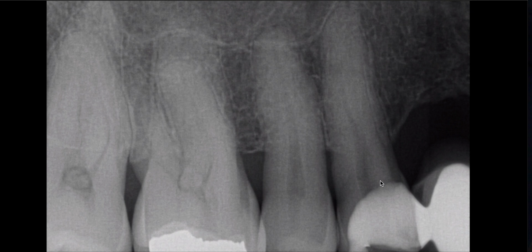We don't see any lesion, we don't see any large restorations, but I think the reason why is we had bacterial invasion of the pulp chamber from the abfraction lesion on the other side. Unfortunately, I didn't take an image of that with my microscope, but there is a fairly decent sized abfraction abrasion lesion on the buccal side. So that's the first thing we're looking for: why did this tooth become necrotic?